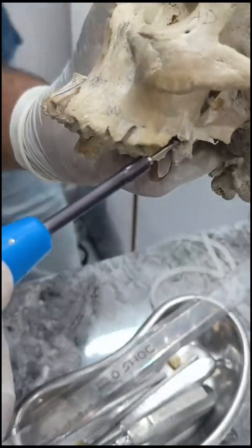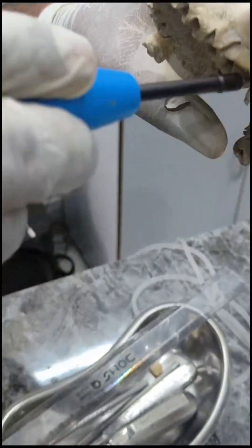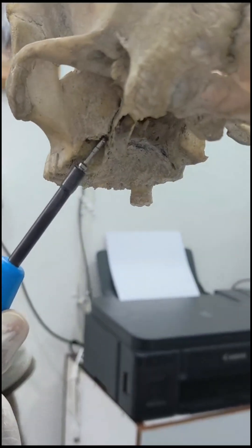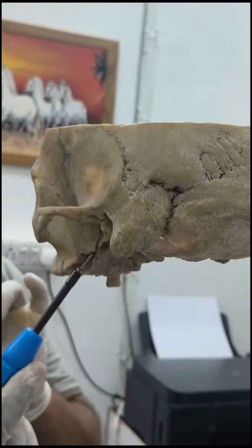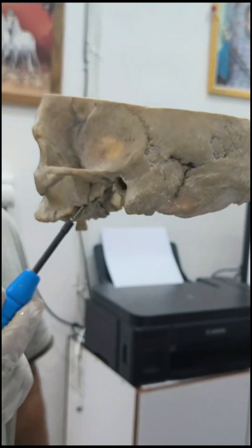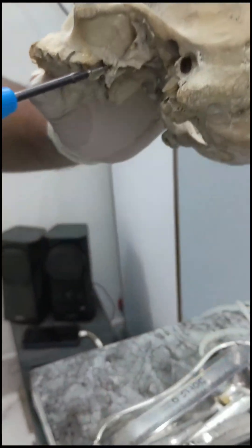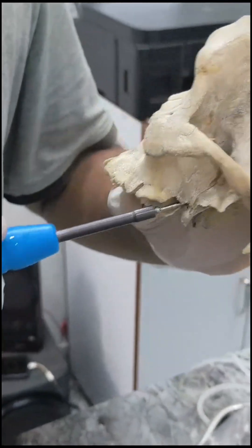Taking the same path I created, I'll try to place the implant — just a few threads going inside. You can see the implant is holding the weight of the skull with just two threads inside. This is the kind of anchorage we get with pterygoid implants. We'll tighten it until the neck portion of the implant merges with the soft tissue.